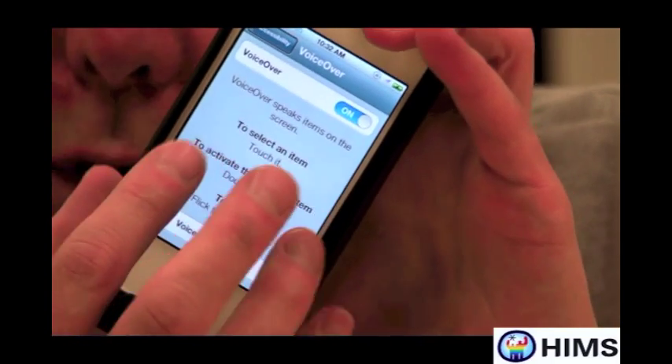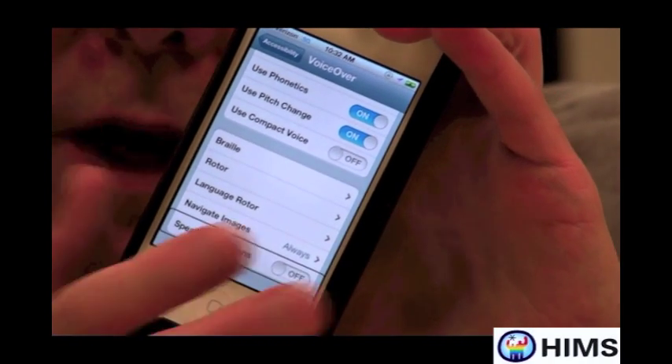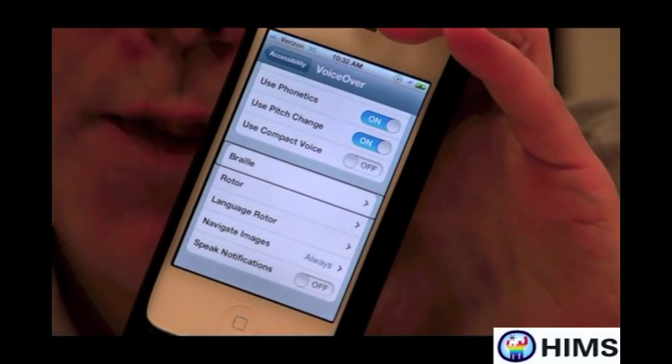I go to the very bottom of the screen and flick left. As I'm navigating, the screen reader reads out items including 'Navigate images,' 'Language,' and then 'Braille.' It took four or five flicks, but I now found the Braille button.